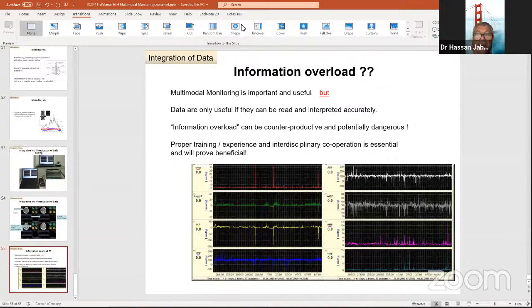In North America, in the neuro ICU, ICP monitoring is really in all patients, unconscious or sedated. Even children, with fontanelle ICP or subarachnoid bolts. It really made a difference, because I lived that. Every time there is a rise, they call you, you do the simple things first, as you said: sedation, hyperventilation, monitoring, whatever, and the ICP goes down. The outcome really benefited so much from the early intervention and management.